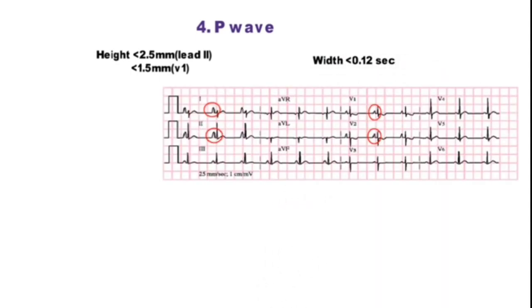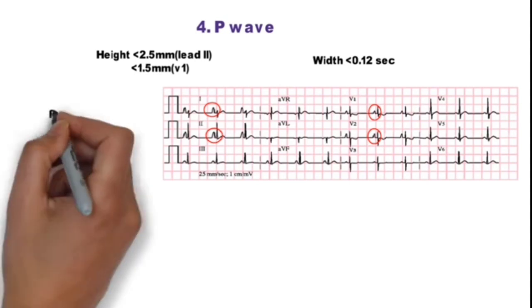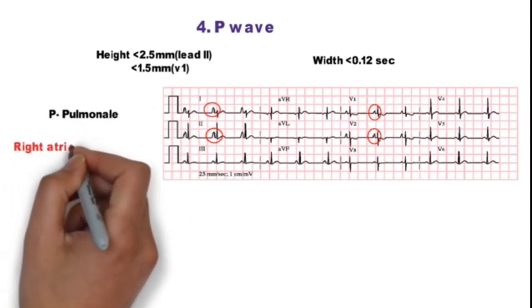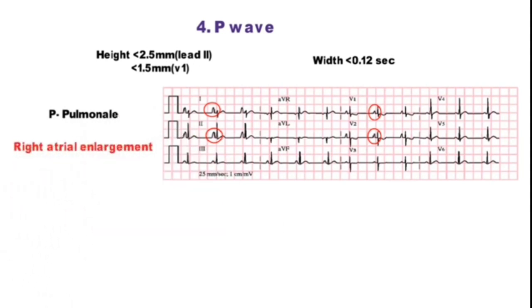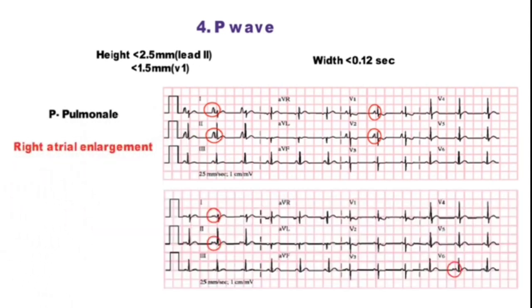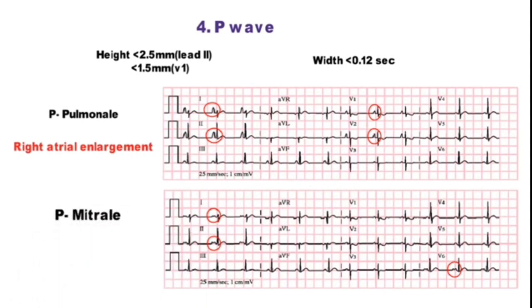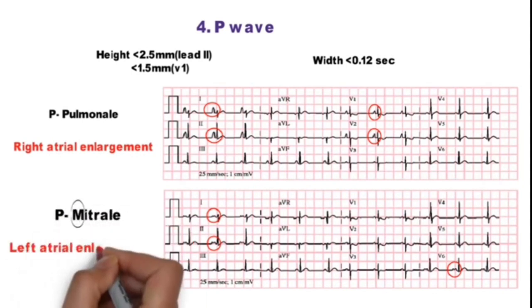In this ECG, in lead 2, P waves are tall and peaked - these are called P pulmonale, which is seen in right atrial enlargement. And if P waves are bifid and have a notch in between, it is called P mitrale, which is seen in left atrial enlargement.